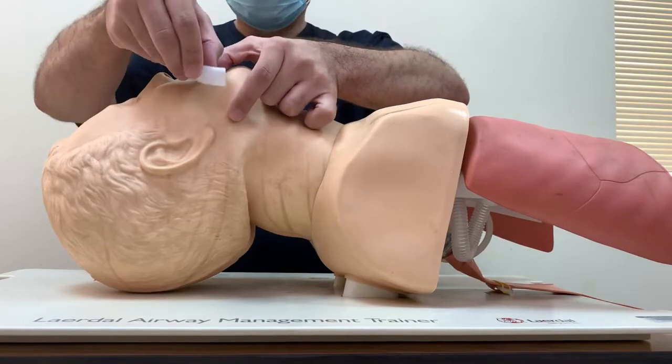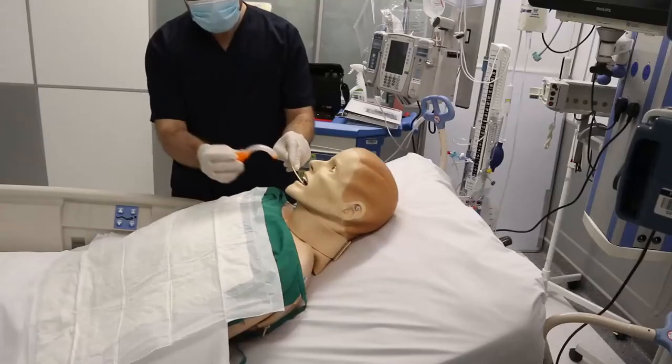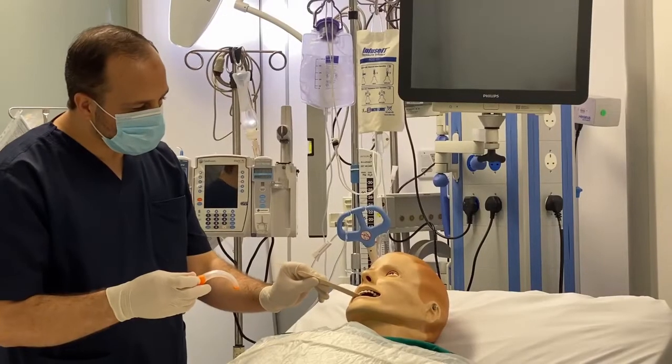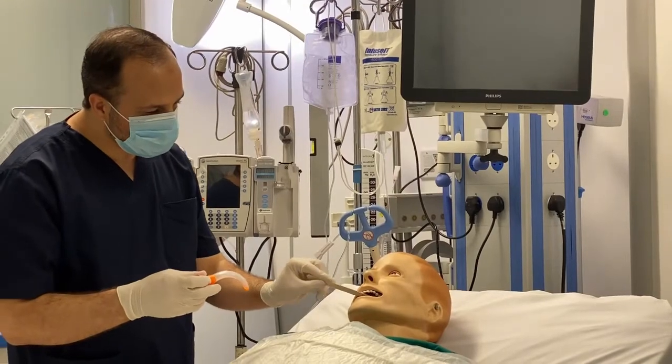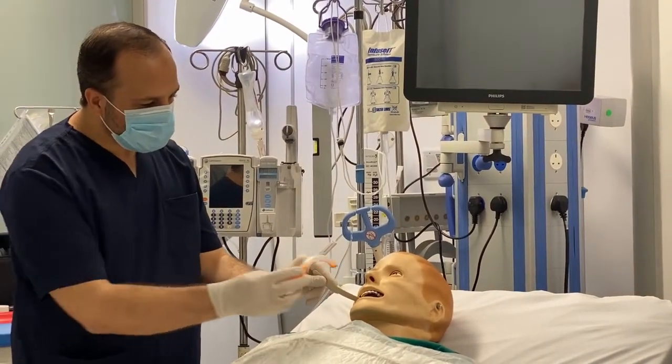The first technique is based on using a tongue depressor, and you insert the oropharyngeal airway as it will be placed in the patient's mouth — in the correct orientation from the start.